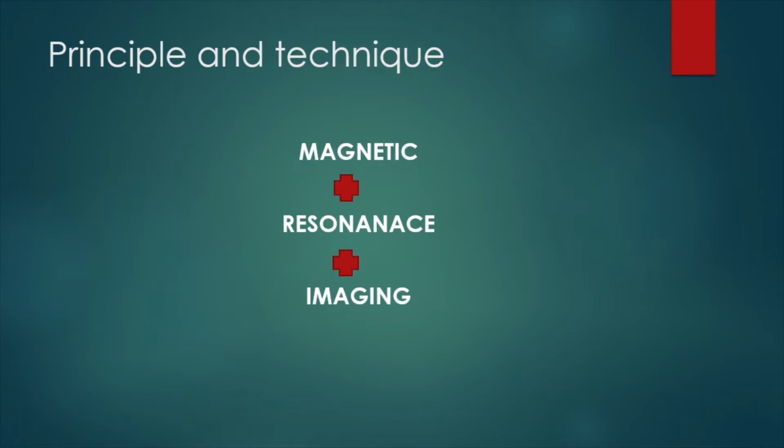So as I have shown, magnetic resonance imaging, MRI, is based on absorption and emission of energy in the radio frequency range of the electromagnetic spectrum. So the inherent electromagnetic activity of the atomic nuclei is manipulated so that we can produce an observable stimulus which can be captured and interpreted specific to certain tissues.